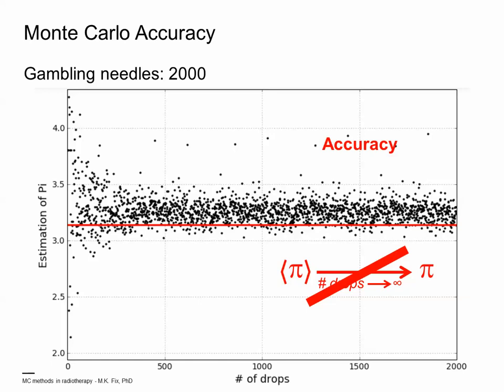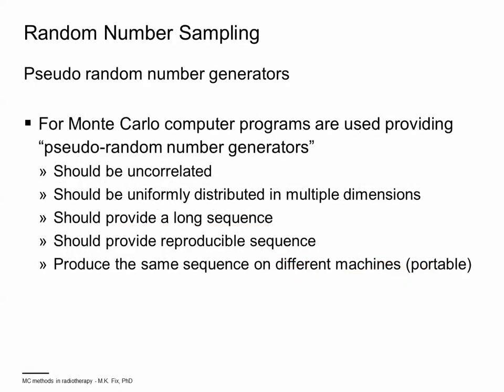One reason why this happens is using an inappropriate random number generator. Thus, what are the features of random number generators used in Monte Carlo simulations? First of all, computer programs are used for this purpose. As the output of any computer program is per definition predictable, not true but rather pseudo-random numbers are produced. The features of such pseudo-random number generators are the following.